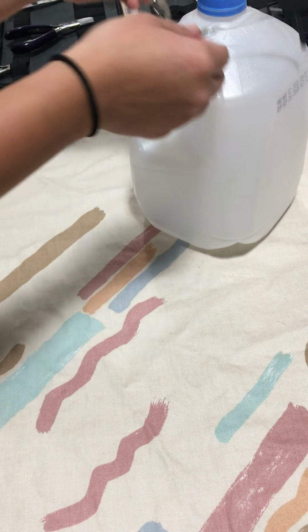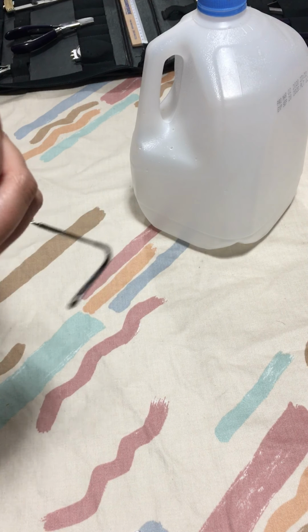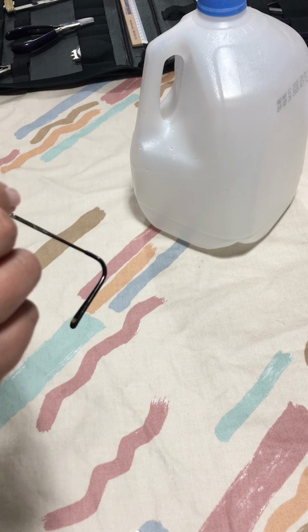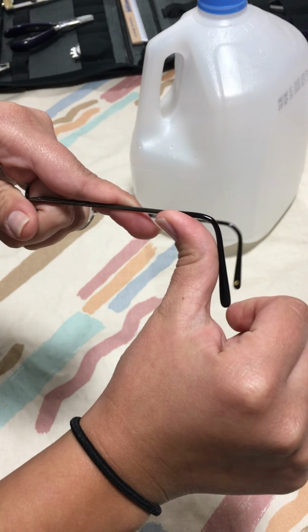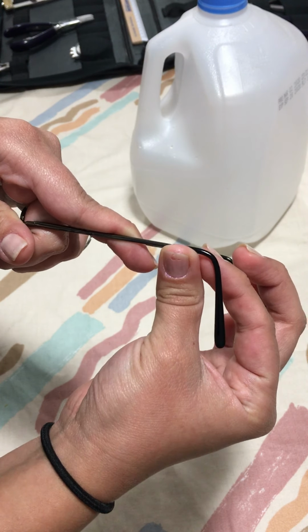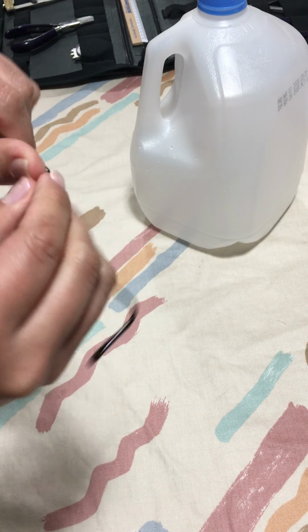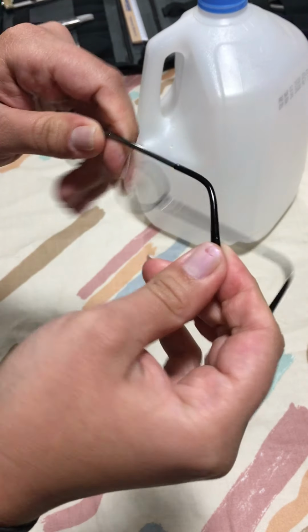So what we could do, in this case, we could heat it up since it has a little metal, but the material allows me to because I double checked it. So what I'm gonna do is I'm gonna straighten it out. As you can see right here, see all that is not supposed to be there. Okay, so what I'm gonna do is I'm gonna stretch it out like this with my finger here, like that, using my finger as the mold.